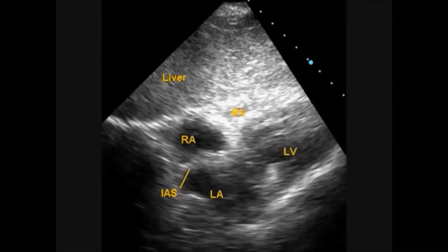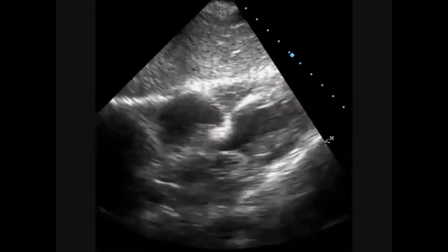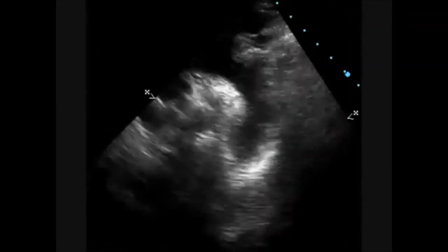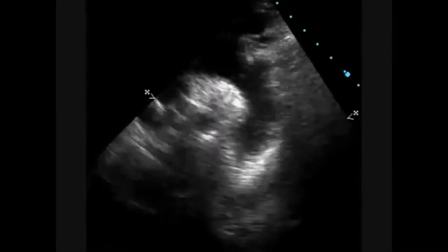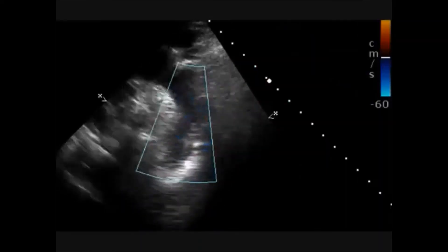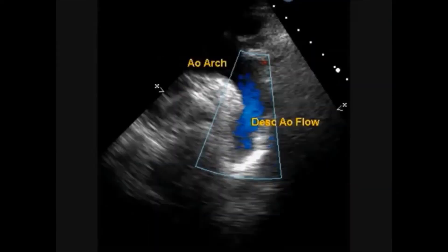Subcostal view shows the intact interatrial septum. Another subcostal view shows the descending aorta, aortic arch, ascending aorta, and cross-section of the pulmonary artery, along with descending aortic flow.